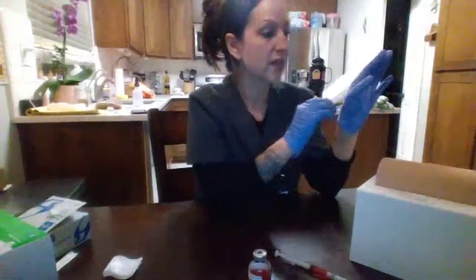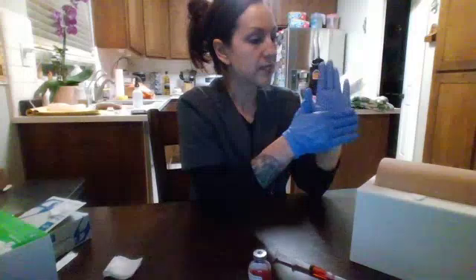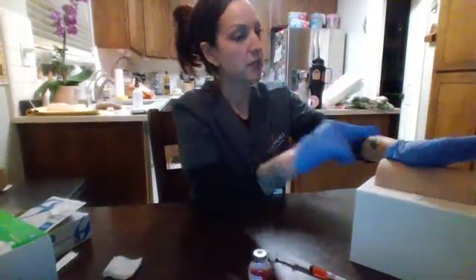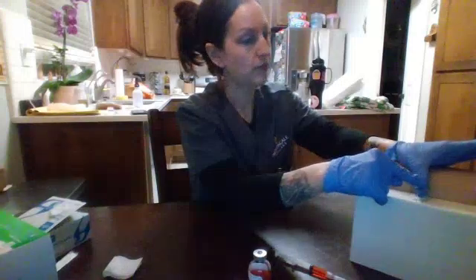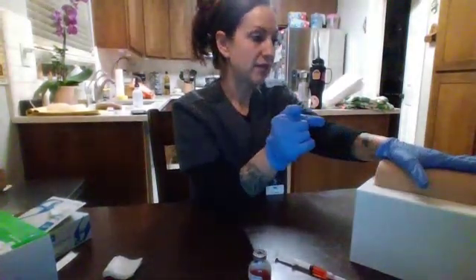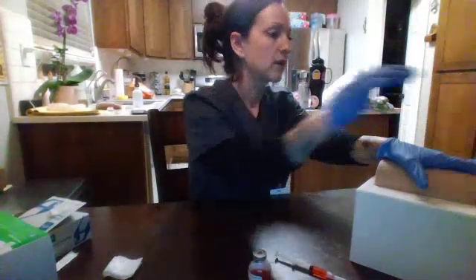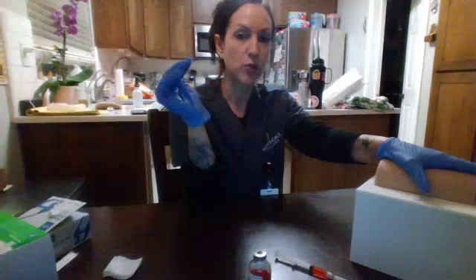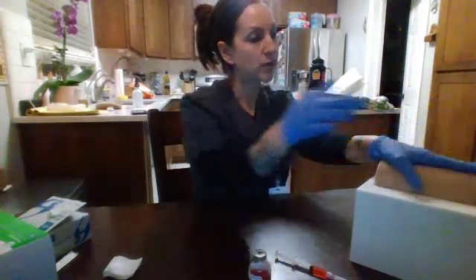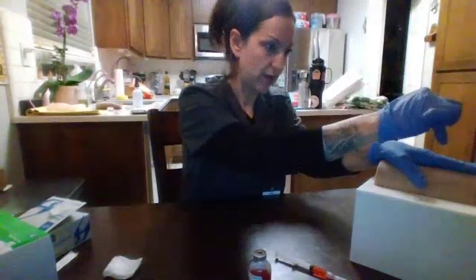Now I'm going to use anatomical landmarks to locate the site. So I'm going to place the heel of my hand on the patient's greater trochanter with my thumb towards the patient's groin. My index finger will be along the anterior superior iliac spine with my middle finger towards the iliac crest going towards the buttock. It's going to be forming a triangle position. And my injection site will be in the center of that area.